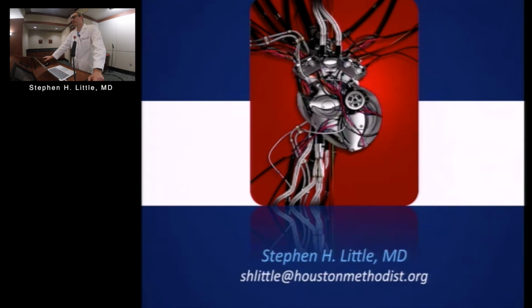We've actually done MitraClips now for mild MR, but with hemolysis, typically after a surgical ring. So I'd say our average time is probably 90 minutes now. It's come down from 4 hours, but that's taken 40 cases to get there.